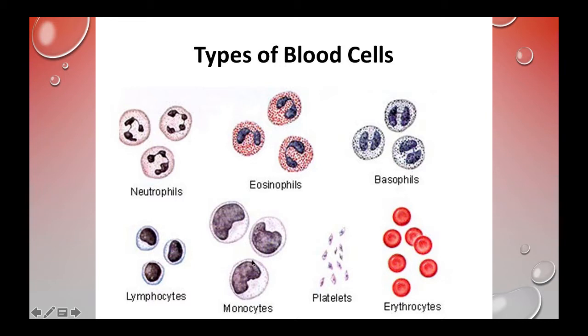They also have a really large nucleus that's slightly curved, often half moon shaped. They're quite a bit bigger than your lymphocytes. These are phagocytic as well, and they make up about 3 to 9% of your total white blood cell count.